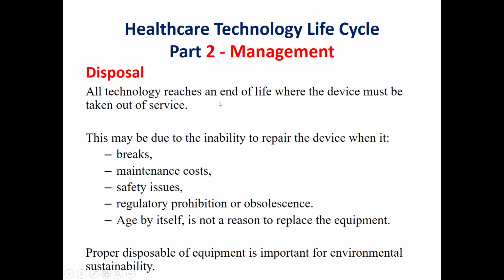All technologies reach an end of life and should be disposed of and taken out of service. This could be for many reasons. One of them is when the device or system breaks, or due to an expensive maintenance cost. Another reason will be safety issues, as we said before. In case we have safety issues considering the use of a special device or equipment, we need to remove it from service and dispose of it.